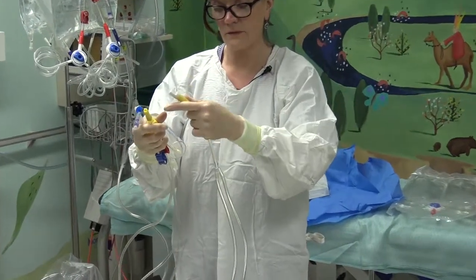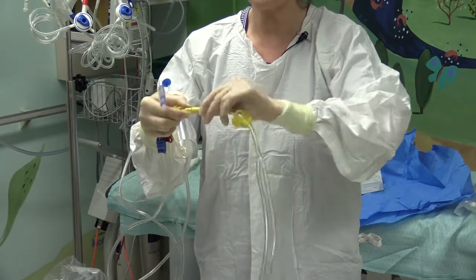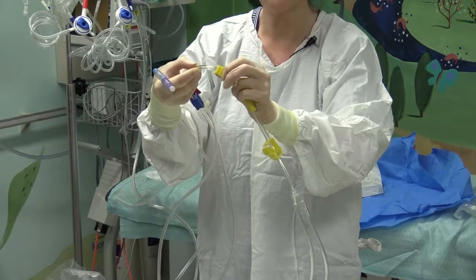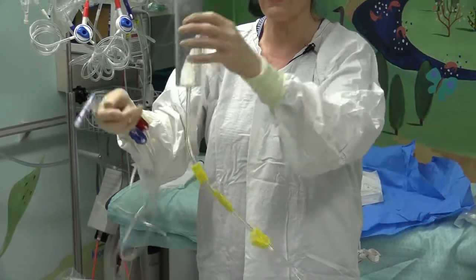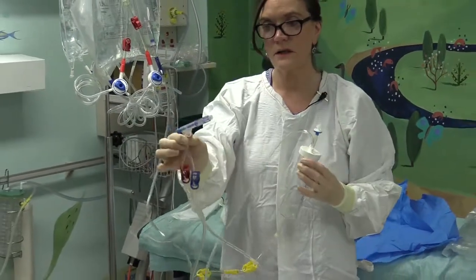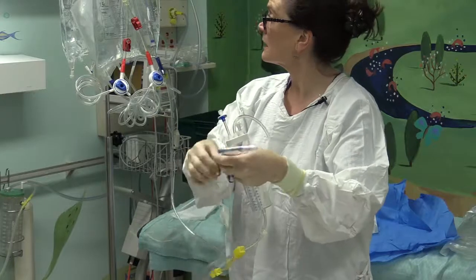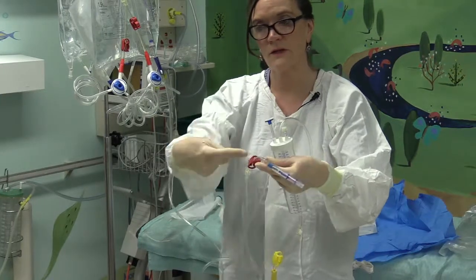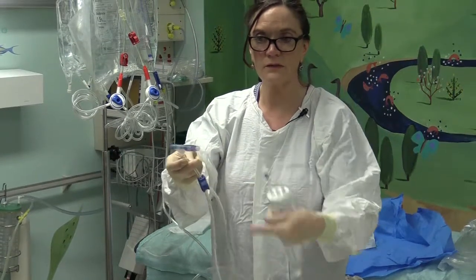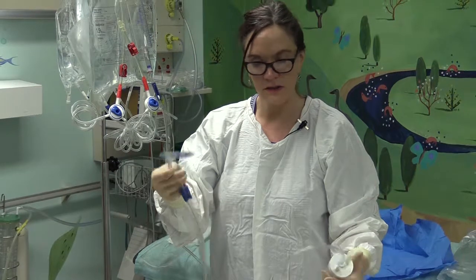So cap off that end, cap off that end, twist the 2 together, and clamp that clamp between the large bags and the drainage cylinder. This end is going to go to the patient. Red indicates filling the patient. Blue indicates effluent flowing out of the patient.